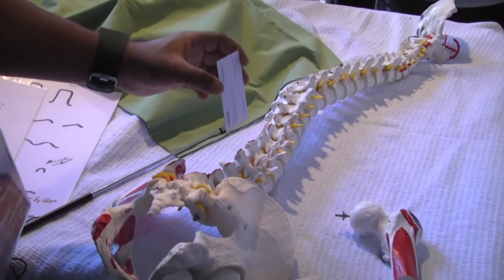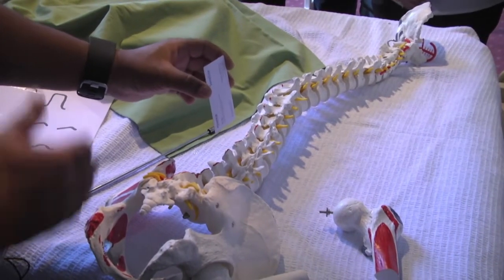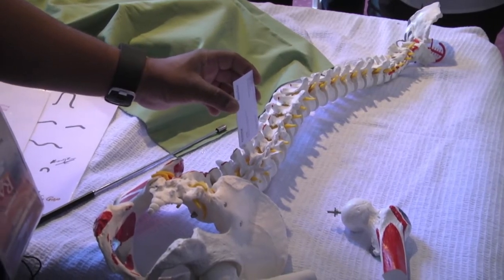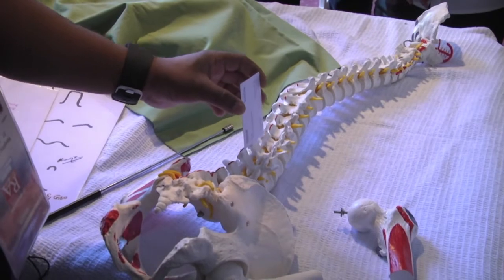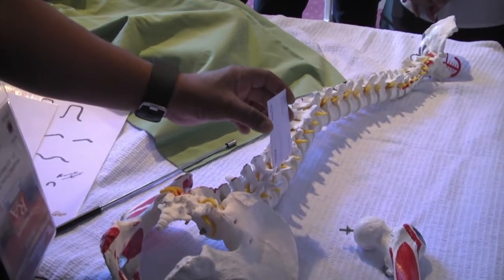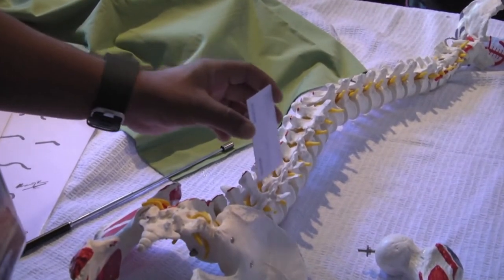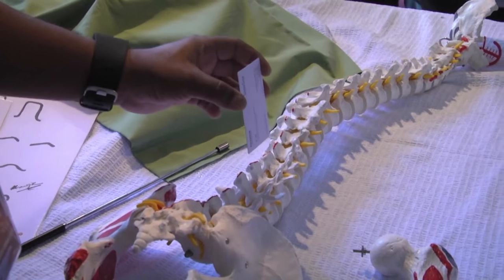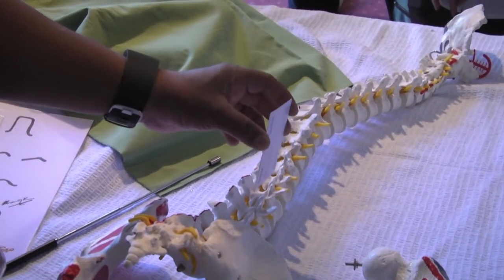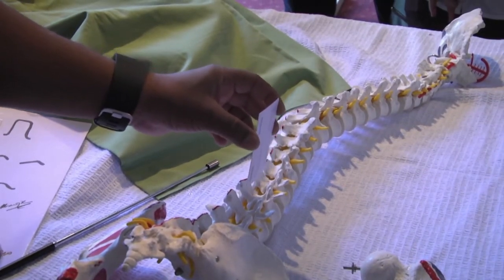Similarly, if I did a sagittal scan, it would be a median sagittal scan. Median means middle. Then it could be a paramedian sagittal scan at the level of the lamina, or a paramedian sagittal scan at the level of the articular process, and the transverse process. So there is a progression of scanning planes, and you can utilize this. For instance, say I'm looking for the lamina and I see the articular processes. It's telling me I'm too lateral. I need to go more medial.